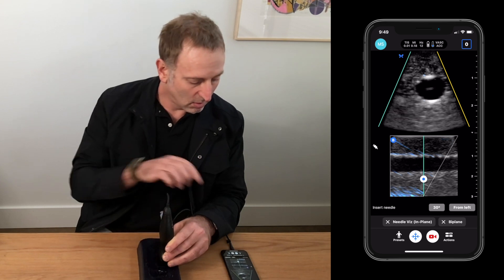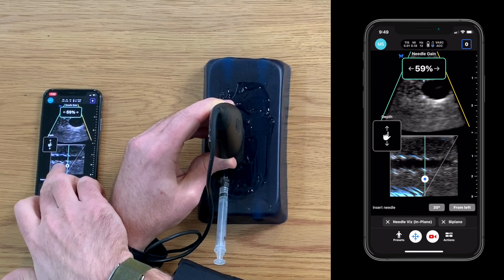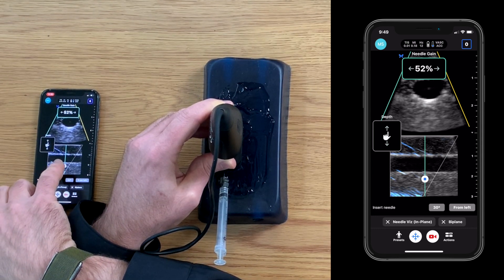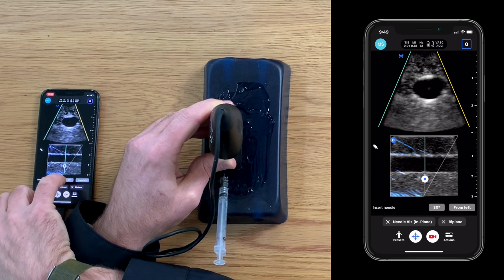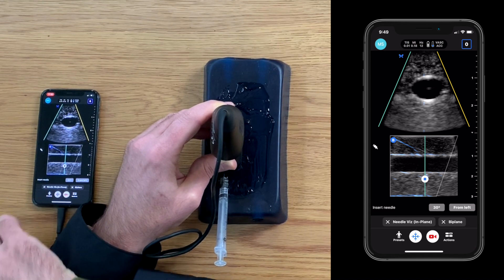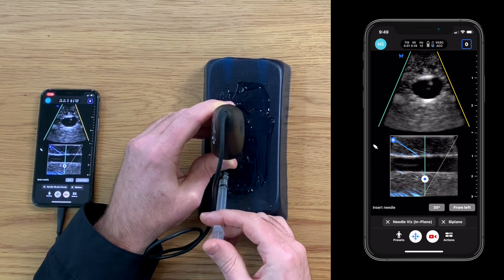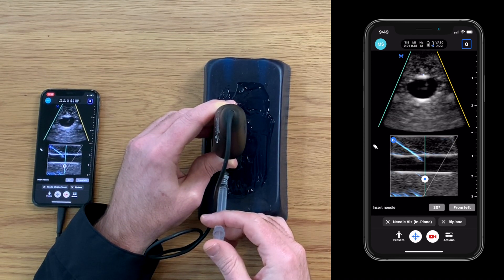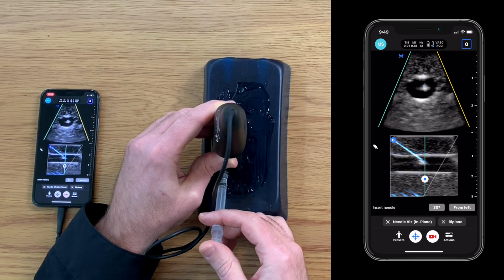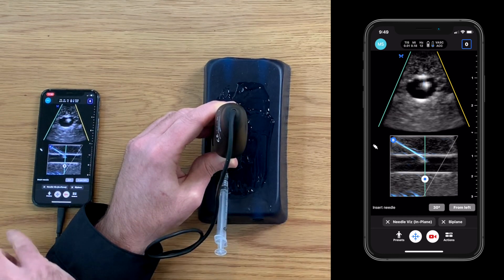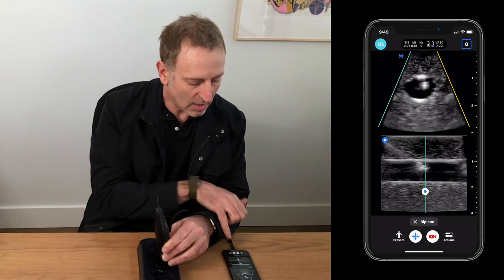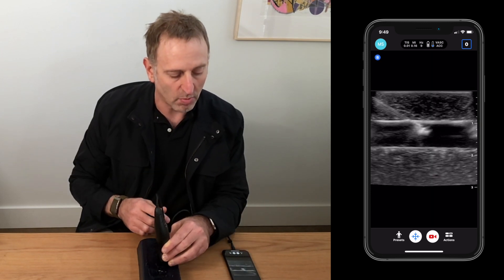We can adjust the needle gain by swiping left or right on the screen — I could decrease the needle gain or increase the needle gain. I can also change the angle of insertion. In this case it's a shallow angle, so 40 degrees wouldn't be ideal, but 20 or 30 degrees would give me the best visualization possible on that needle as I insert. I'm able to see a really nice image of the needle highlighted in blue. As it crosses the plane, I can see that again in short axis on the upper image — so that's needle visualization with biplane simultaneously. If you want to remove NeedleViz, simply press the X and you're back to biplane alone. And if you want to remove biplane, press the X and you're back into a two-dimensional image.